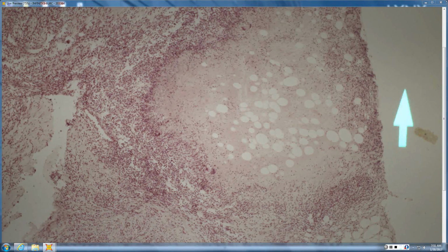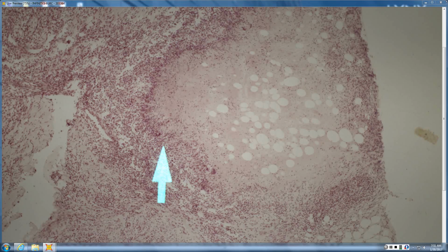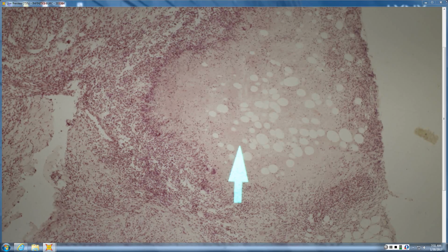A ring with something else in the center. And what would you call a ringed granulomatous infiltrate? Palisaded, and it's palisaded with some multinucleate giant cells in the wall. Right. And so what's in the center of the palisade? The fat. There's fat, so it's sub-Q.